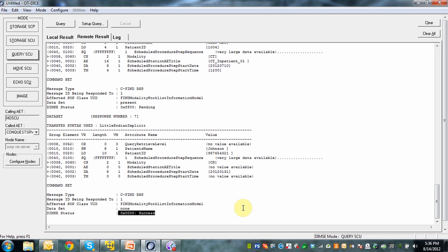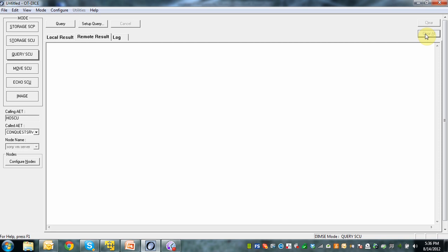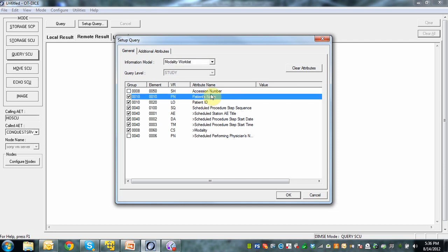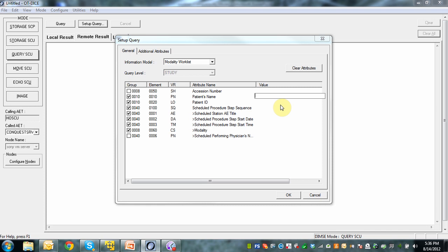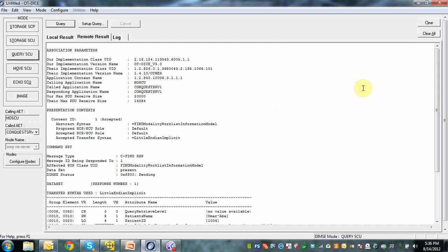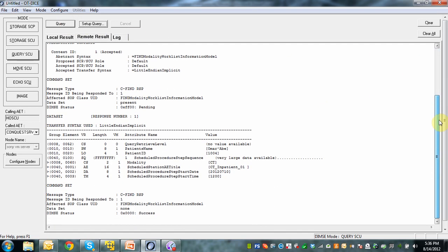When you do this wide-open query, you might not want to do that to your production database because you might get quite a few responses back. To see how the behavior of the modality worklist provider works, go back to setup query. I want to do a single value matching on patient name — I double click, type 'O*' for example, which means I'm going to select only patients whose last name starts with O. I do my query and here you see only one response comes back — it was Mr. Omar.